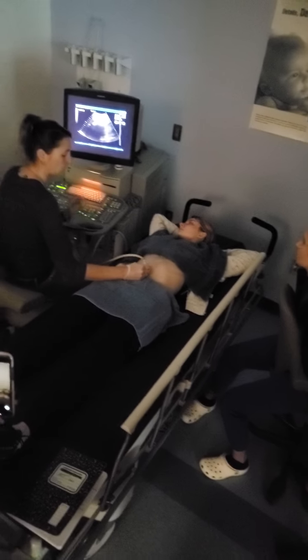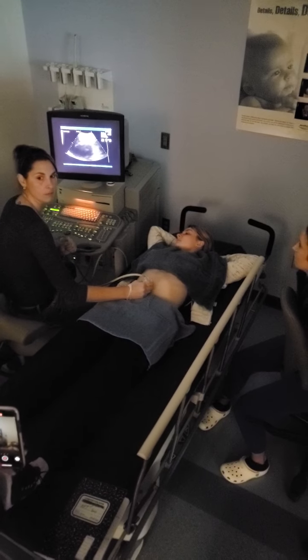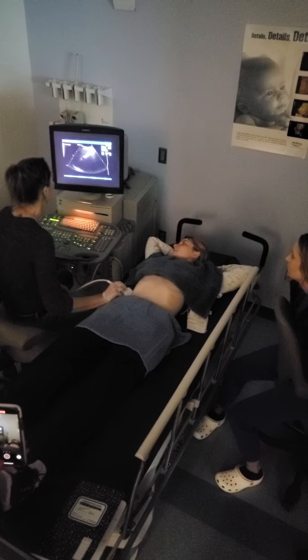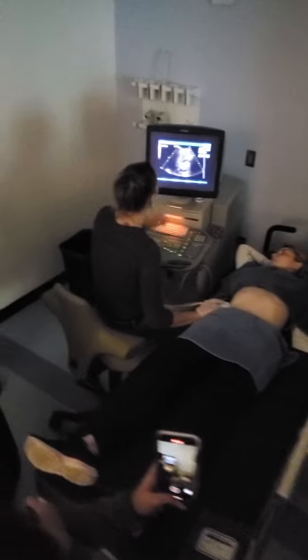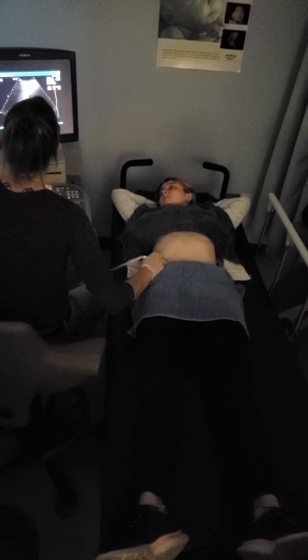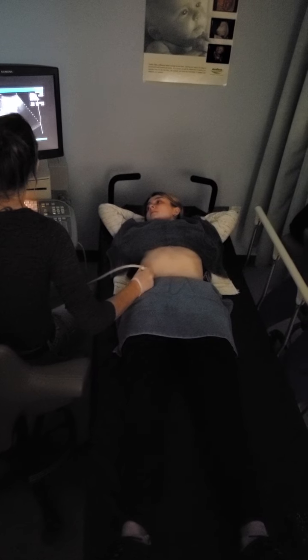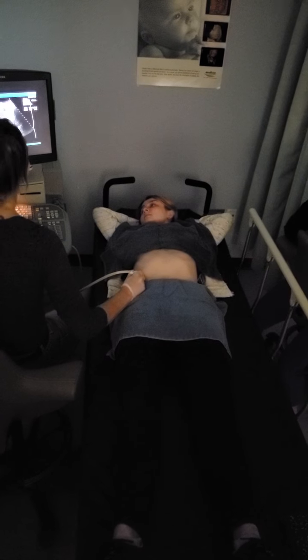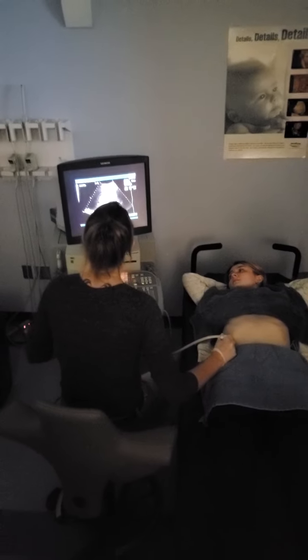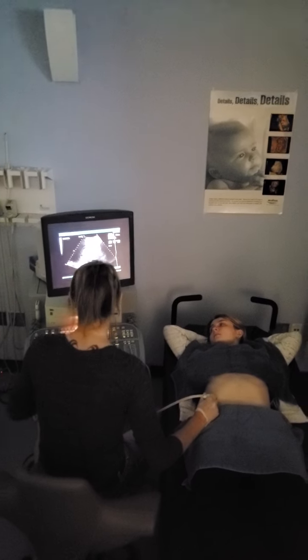And if we have bowel gas, where am I going to go? Lateral or even posterior. Yep. So we did that, and we cut that in for your border. So here's our IVC. So we're going to come just slightly to the right of that IVC. So we had a medial, mid, lateral. We ended at the mid clavicular. We did our measurement right in here. Kind of breathe. Caliper right on the edge of our superior posterior, inferior anterior. Does not have cirrhosis. That's excellent.